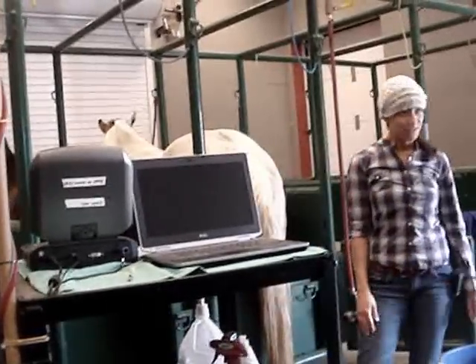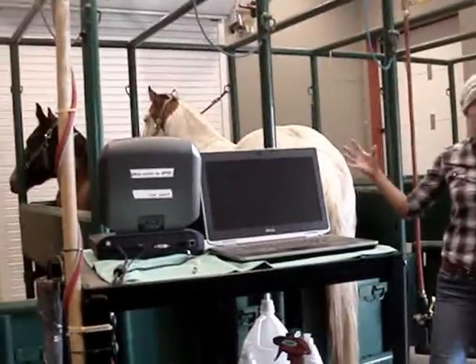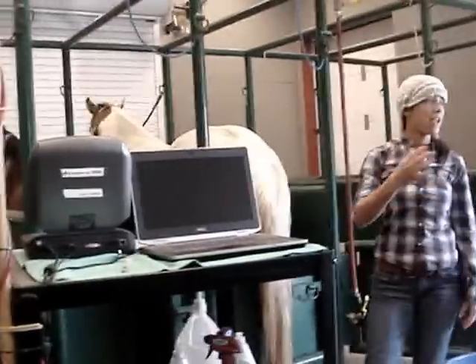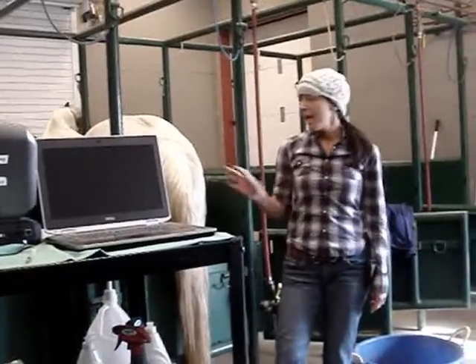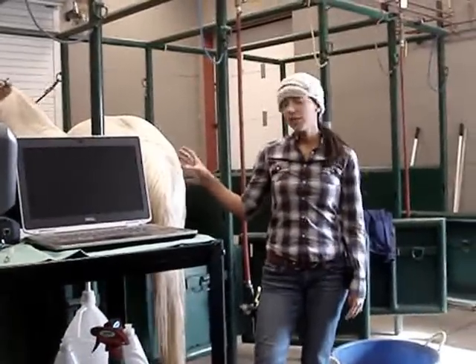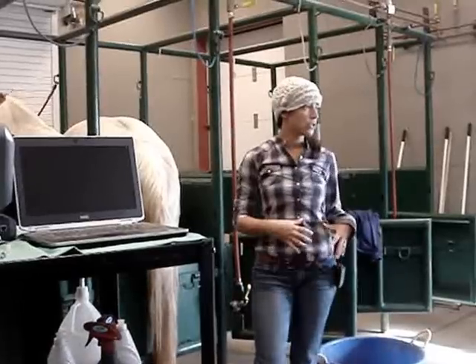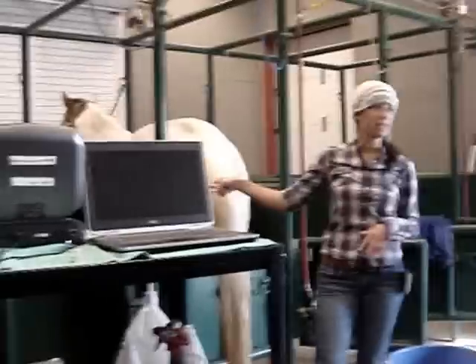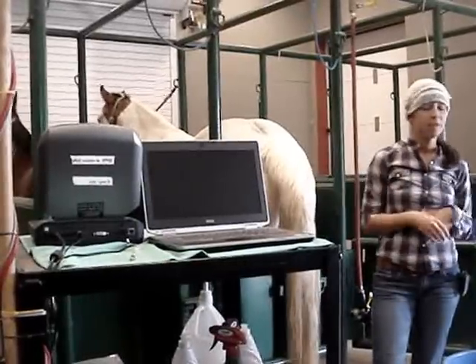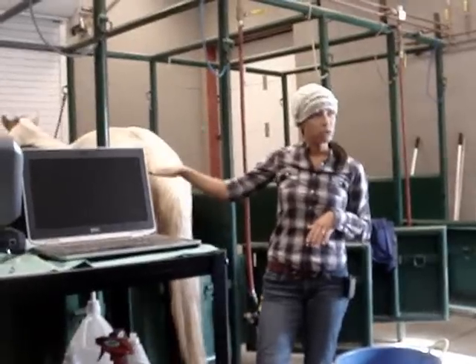So for those of you who haven't seen it, the way that we monitor mares' reproductive cycle and to determine where they are and whether or not they're ready to be bred is to do ultrasonography. And the reproductive tract of mares is too high up in their abdomen, and there's too much intestine and bladder and all sorts of crazy stuff for us to do it just through their abdomen like you would on a pregnant human.